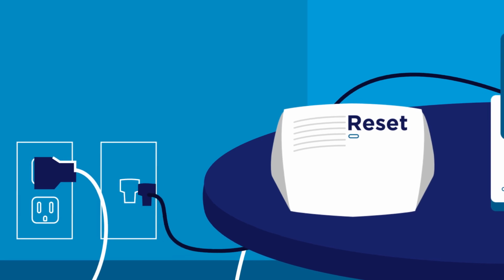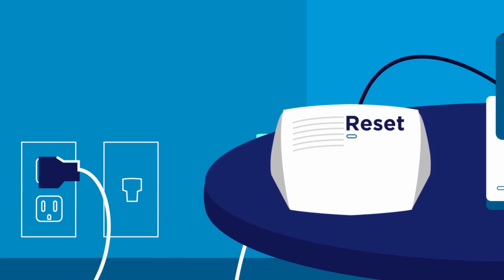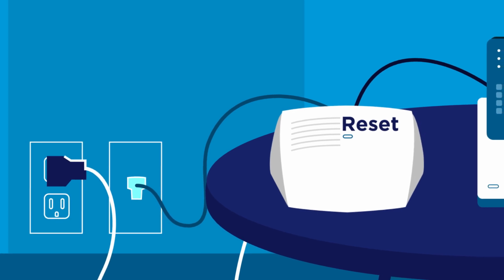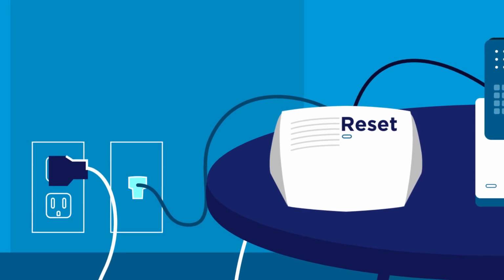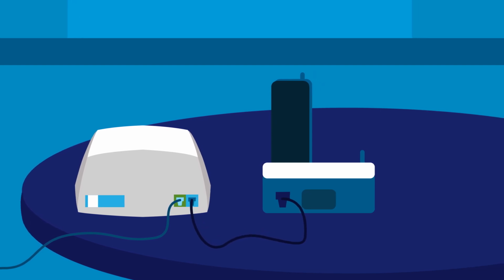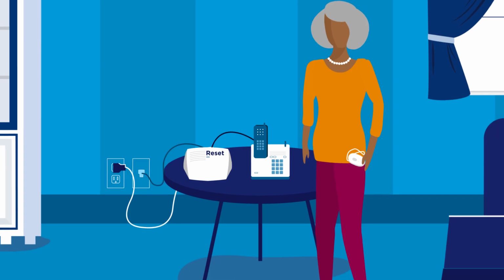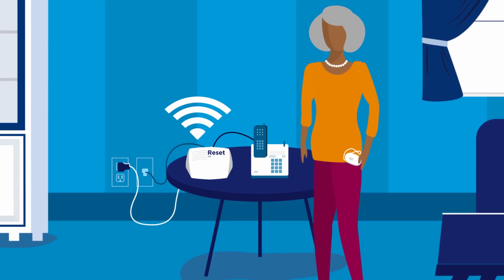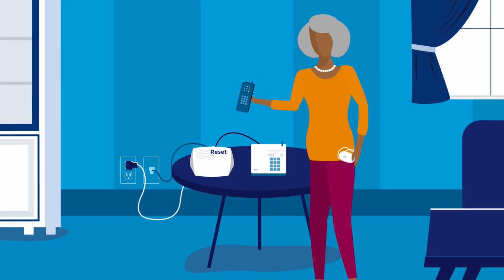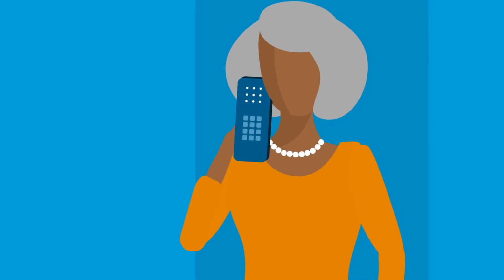Now unplug your landline phone cable from the wall jack and plug the clear end of the phone cord that came with your home communicator into that wall jack. Then plug the cable from your landline phone into the blue jack on the back of the home communicator. The home communicator will say, "Good, your communicator is now plugged in." If you've completed this step correctly, you should hear a dial tone on your phone.